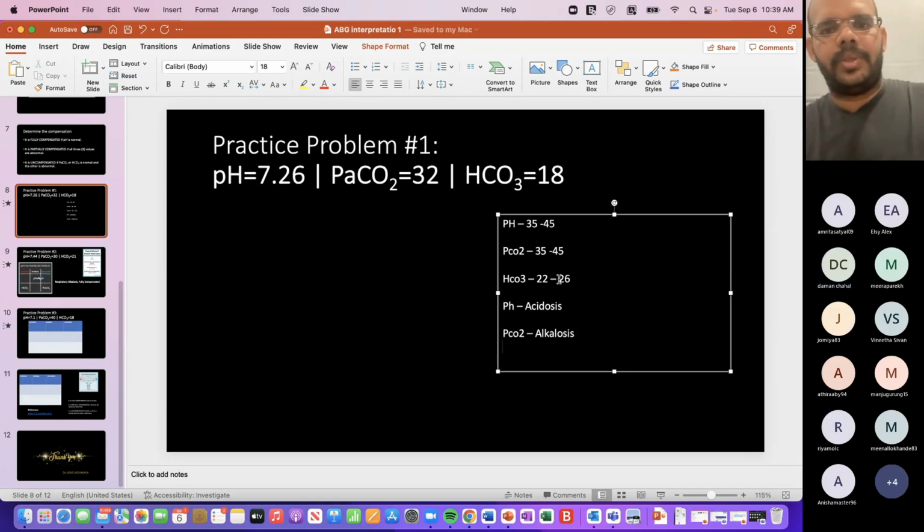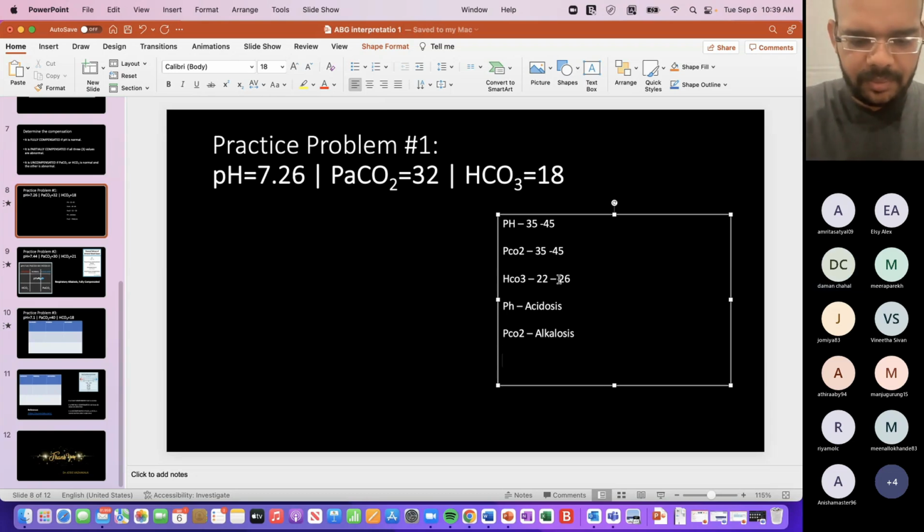Okay, very good. And bicarb is less than 22, so it's acidosis. Yes. So now tell me what is the problem here?